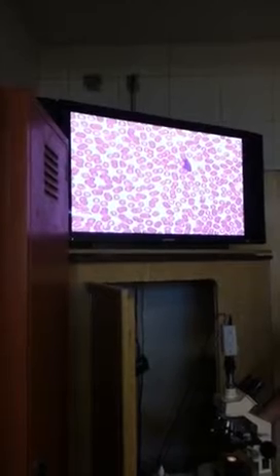That's actually an autolysed leukocyte. It's actually lost its membrane, it's breaking loose and open. So based on what we know, what is that? Neutrophil? Neutrophil. You guys are getting this, not too complicated. All right. That's just to remember the parts of each one.